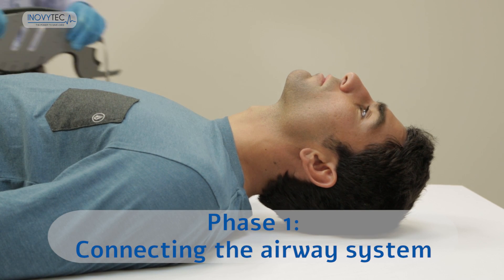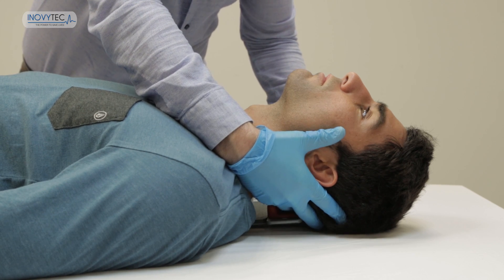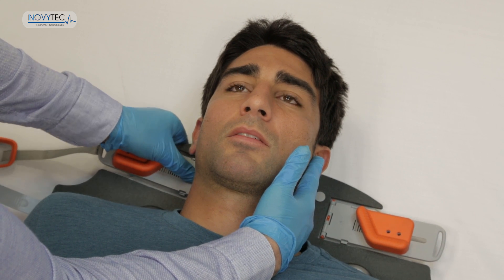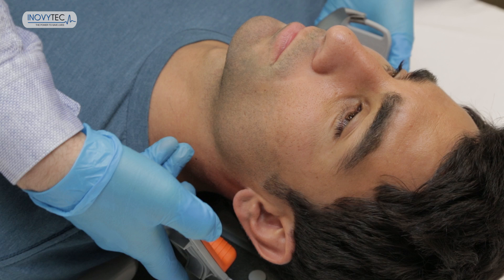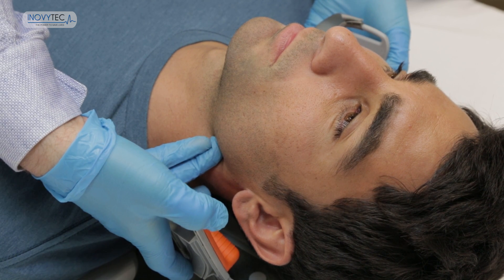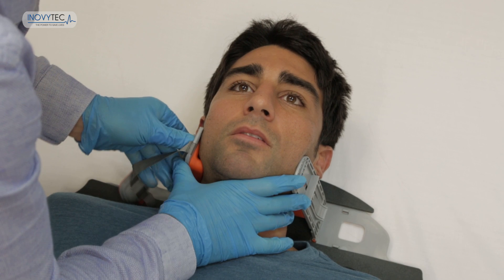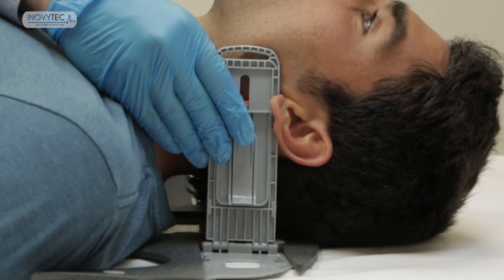Phase 1: Connecting the Airway System. Slide the Lubo under the patient's neck gently. Do not move the patient's head. Hold the Lubo by the arms while placing your thumbs above the arms and your forefingers below the arms. Find the patient's mandibles with your fingers and place the mandible's cups in the mandible area while holding the Lubo's arms tightly to the patient's face. Verify that the patient's earlobes are free.